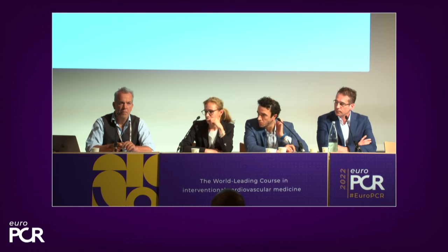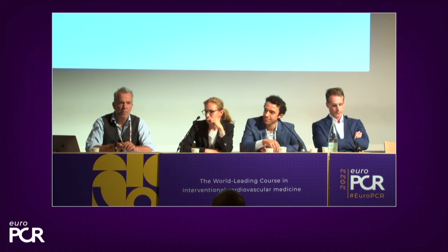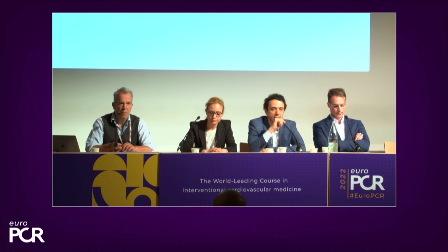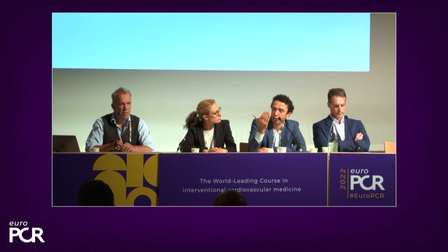Maybe on conduction disorders and pacemakers, Guy, what is your take in younger patients? What can we accept, and what would be unacceptable? Yeah, that's a very relevant question. I think we have to aim at achieving close to surgical results, right? We know that with the current technique, pacemaker rates drop tremendously, with optimized procedures now at single-digit pacemaker rates.